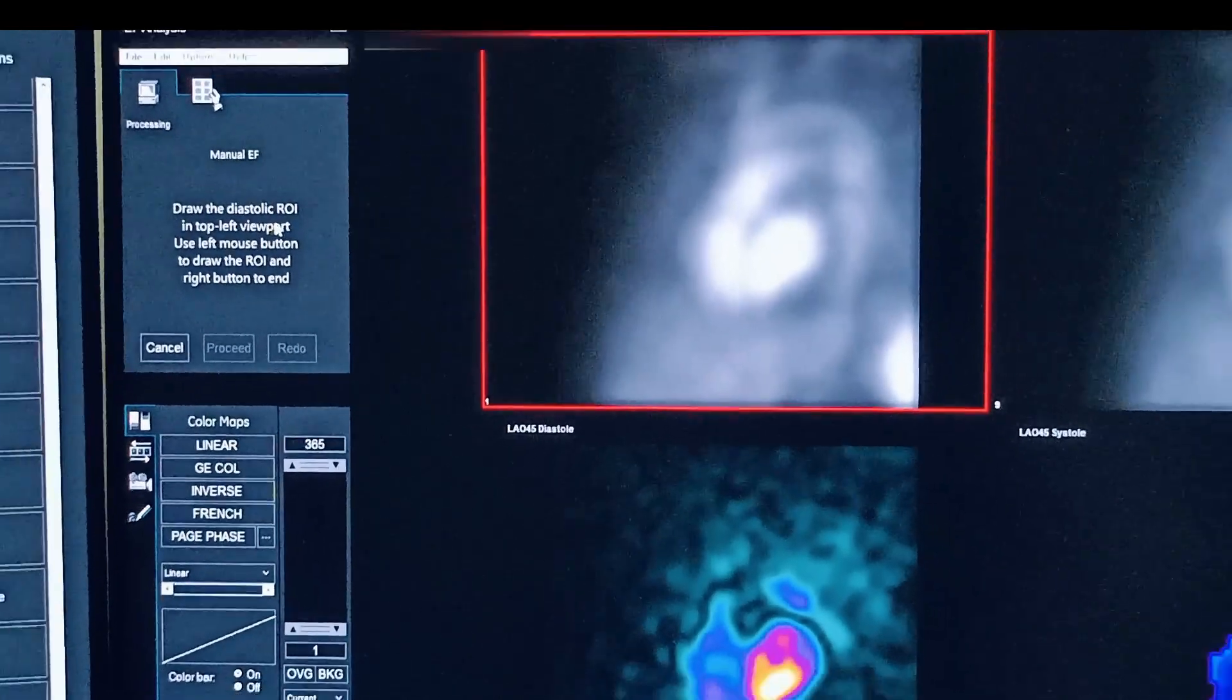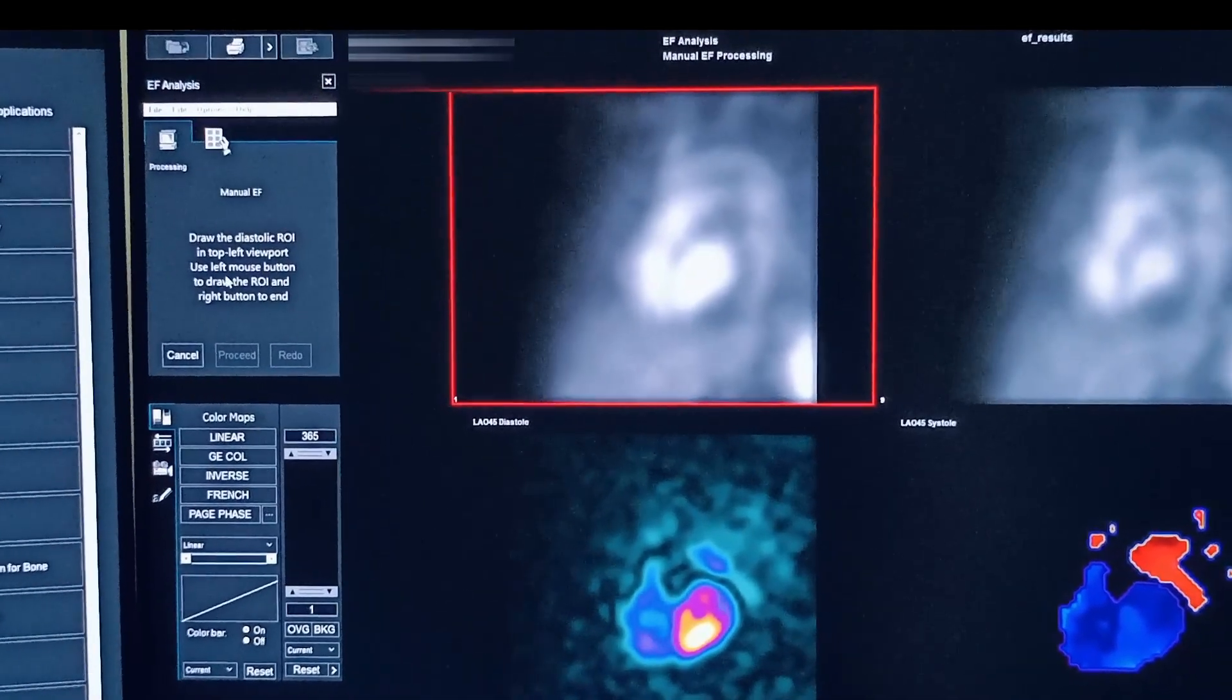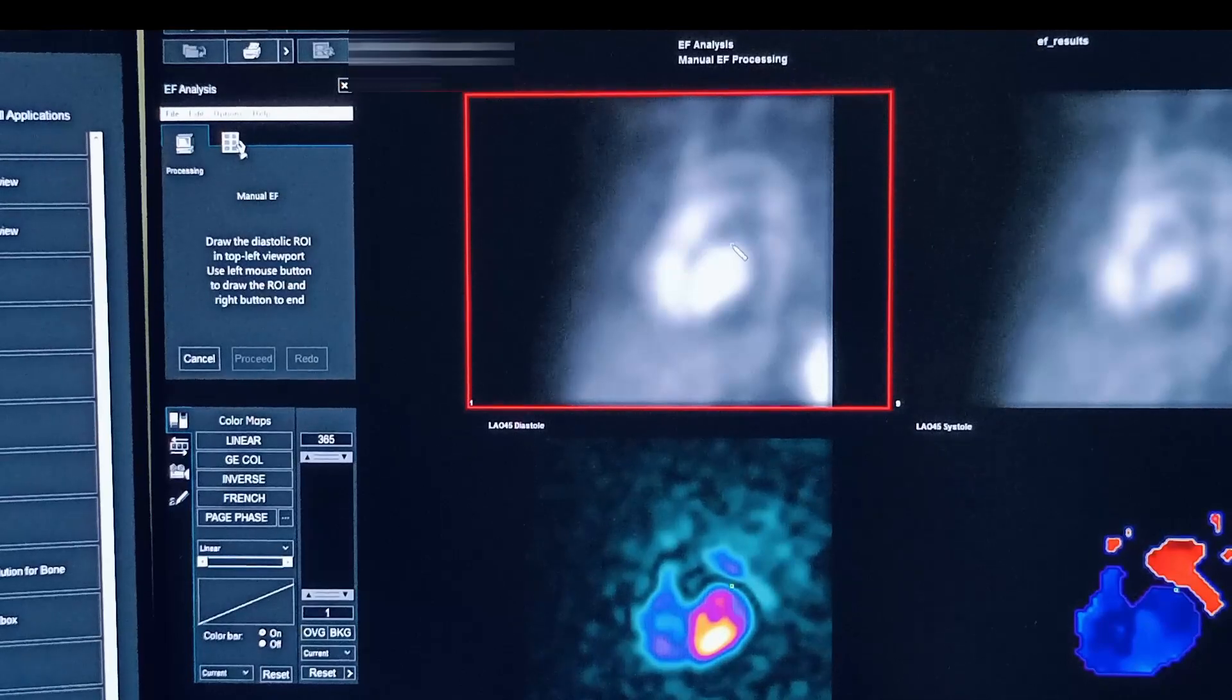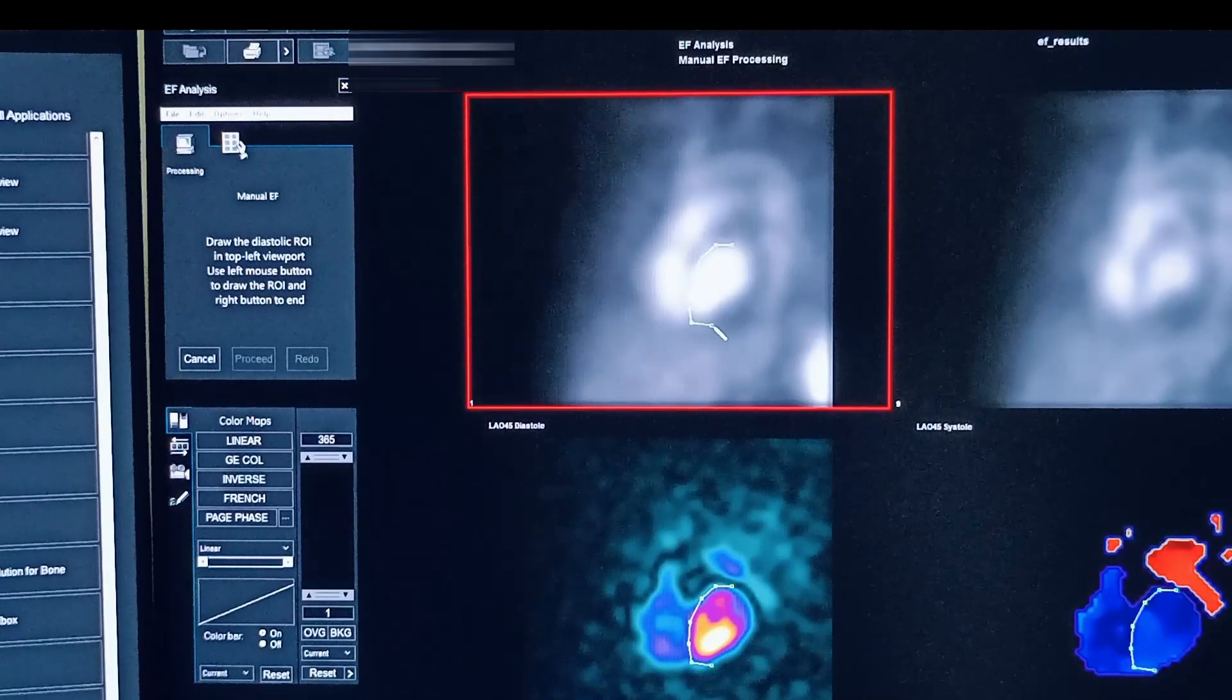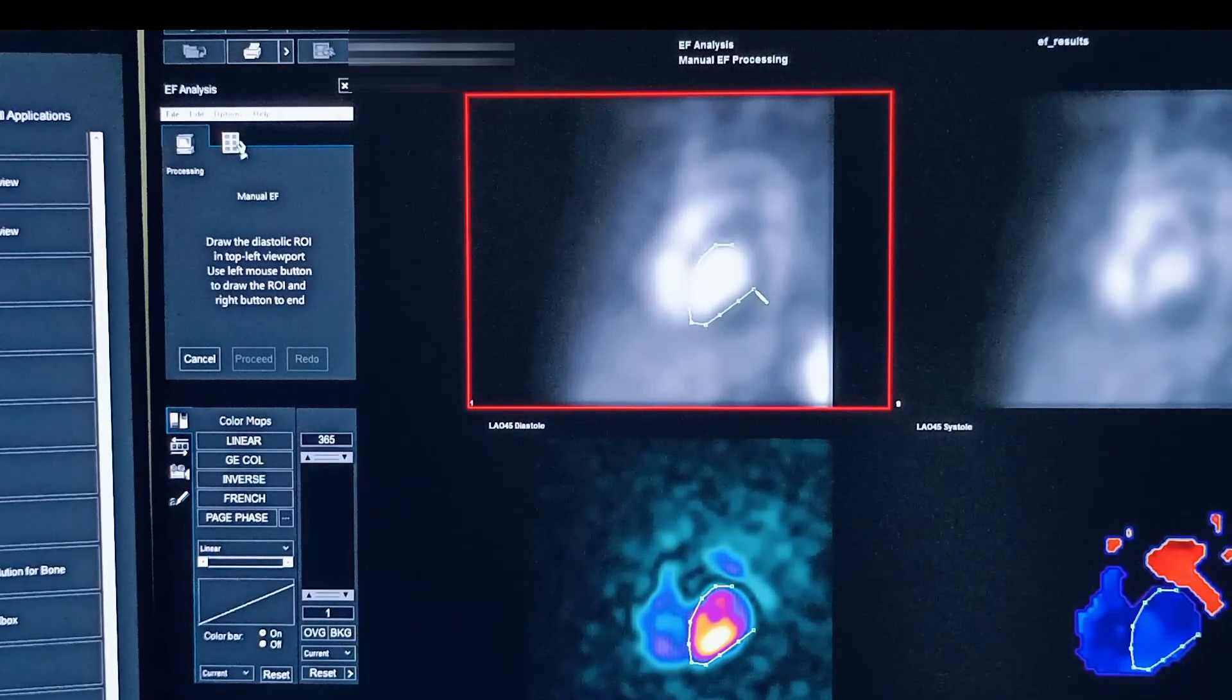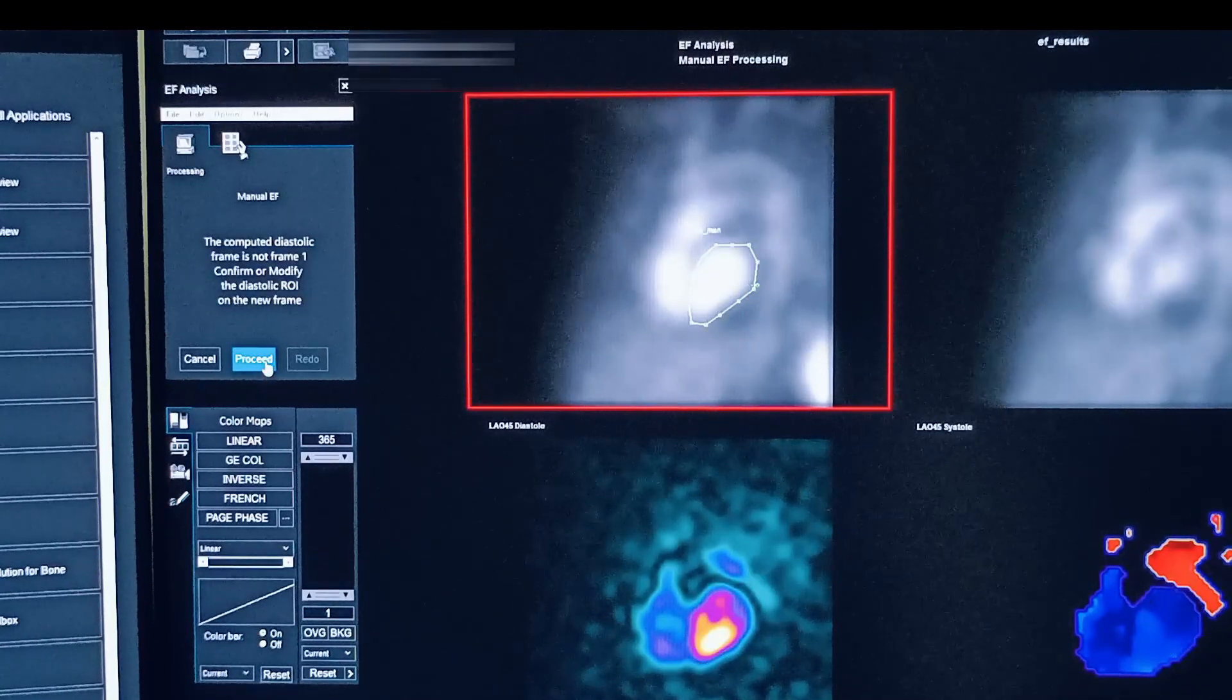You have to draw the diastolic ROI on the left top viewport. This is the option. Draw the ROI, then click proceed.